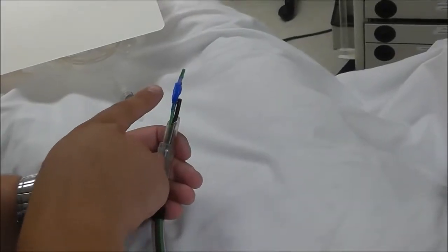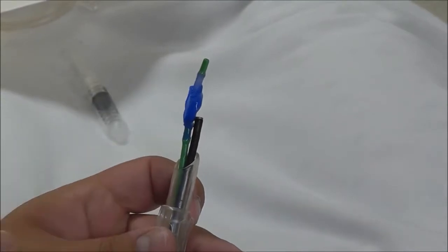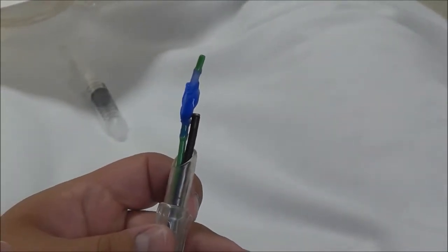Once the bronchial blocker is advanced past the level of the scope, you can visualize the twisting motion which directs the bronchial blocker into either bronchus.